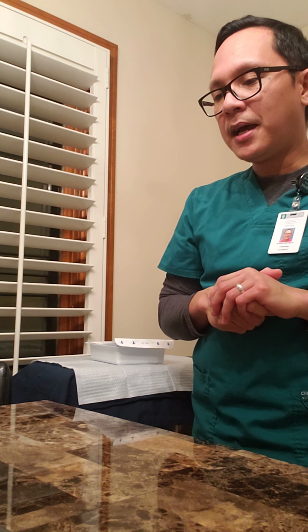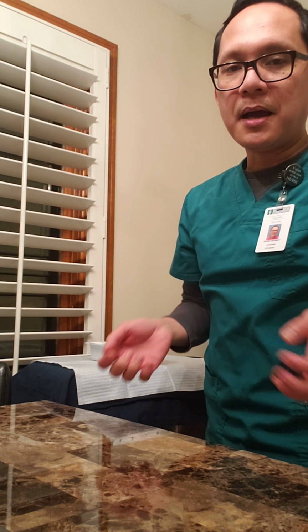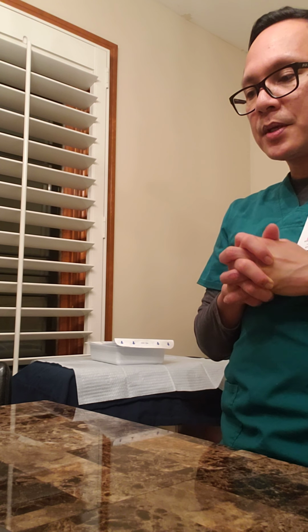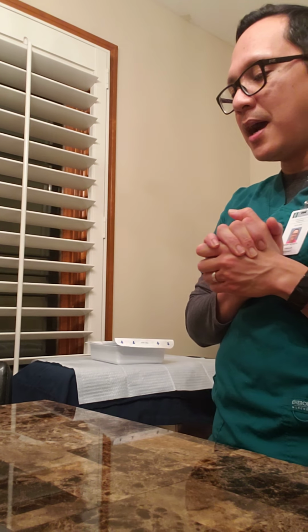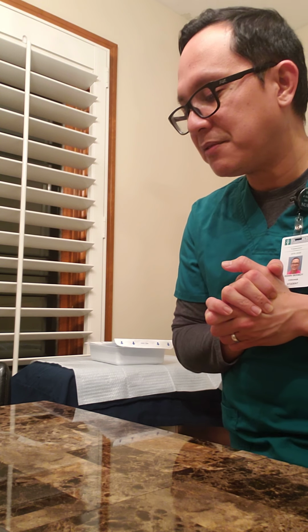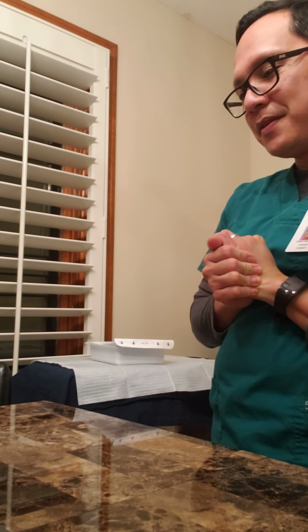All right, at this point in time, I'm going to bring my patient's bed up to a good working level on my end, and at the same time I'm going to have my patient lie on his back in a supine position, just to make sure that by lying in the supine position we're reducing the risk of any air embolism as well. My patient has his central line on his left arm. I'm going to ask him to just raise his arm where the central line is. Okay, thank you very much, sir.